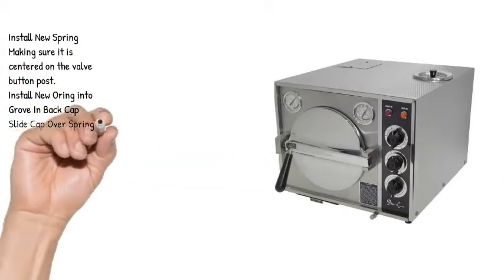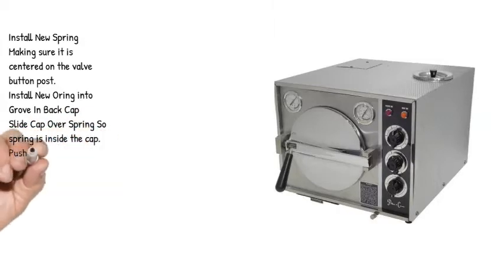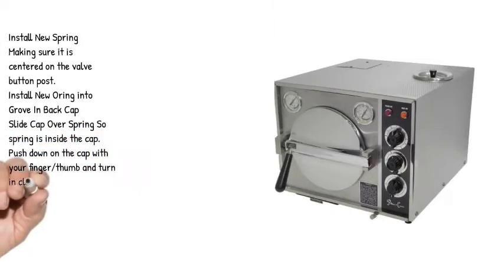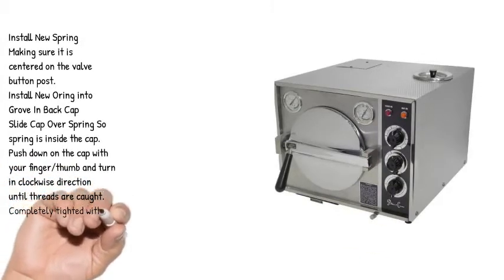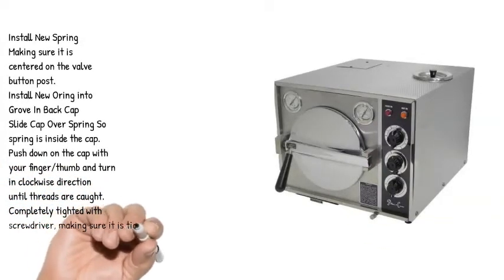Install new o-ring into groove in back cap. Slide cap over spring so spring is inside the cap. Push down on the cap with your finger or thumb and turn in clockwise direction until threads are caught. Completely tighten with screwdriver, making sure it is tight.